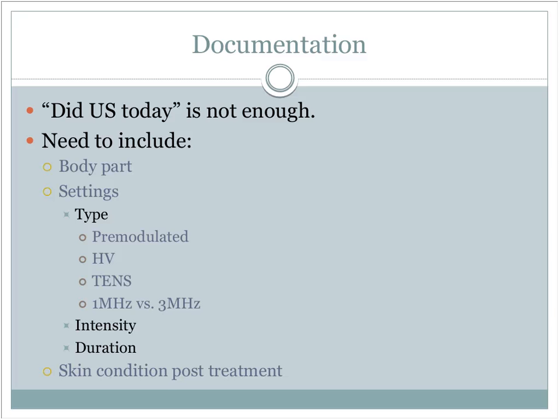You should also really include the skin condition after the treatment, and that sometimes means you have to let them sit for 15 minutes. Certain forms of eStim, certainly direct current if you're doing that, but even the high volt can create some redness, some erythema underneath the electrodes. That's perfectly normal. Does the erythema go away within 10 to 15 minutes?